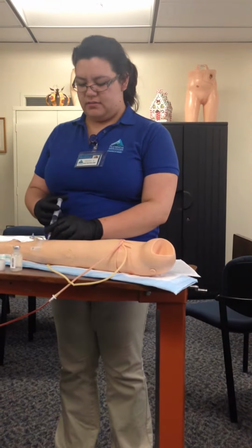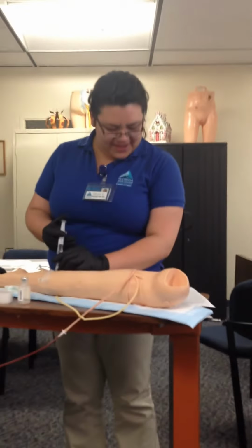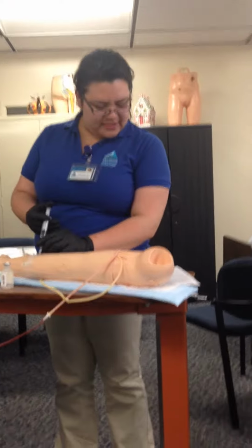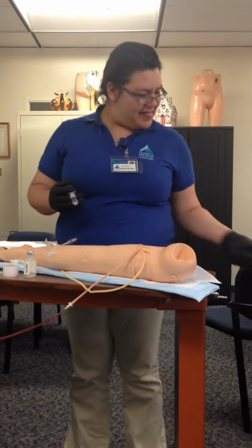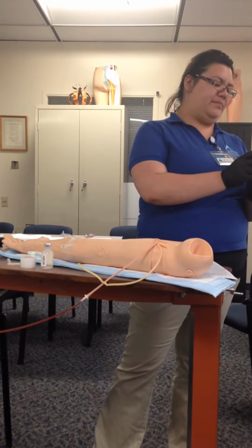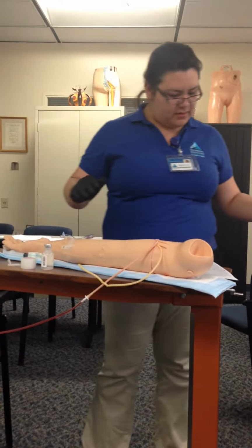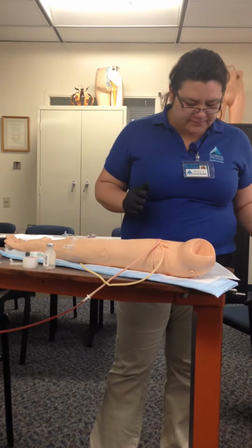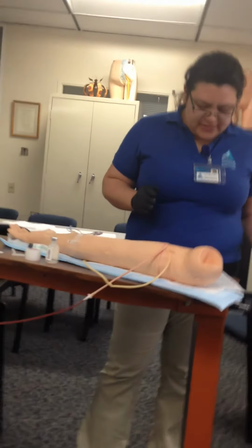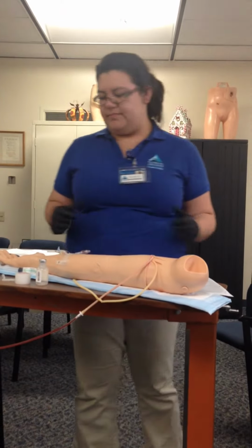Flush the line with 3 cc's, I'm sorry. And then okay.